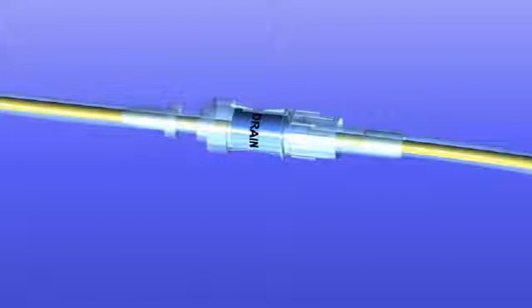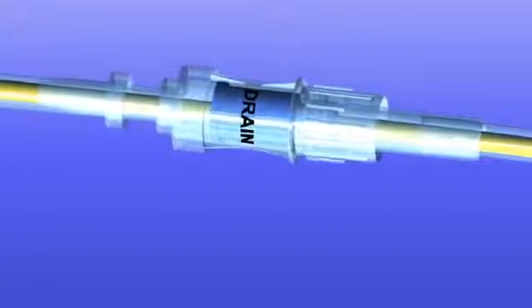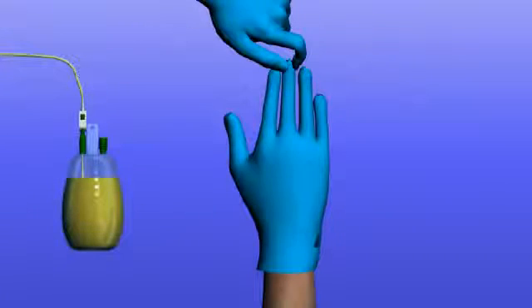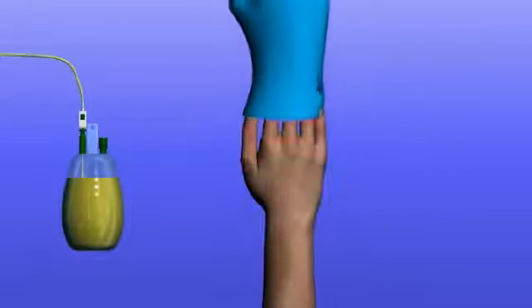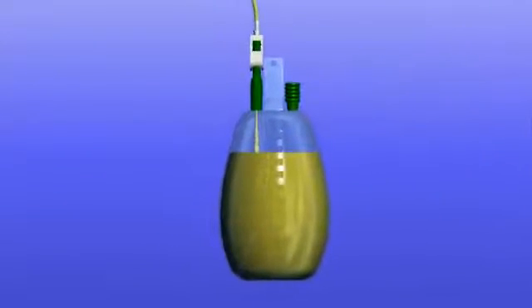The fluid will flow into the vacuum bottles. If there is no or very little fluid flow, check and ensure that the connection between the connector and the valve is tight. Remove your gloves and discard. The drainage procedure will generally take 10 to 15 minutes.